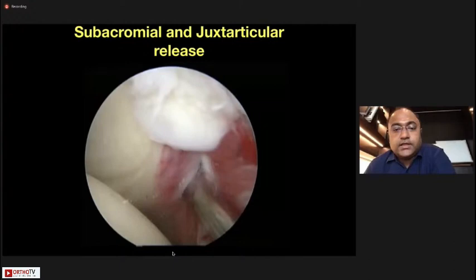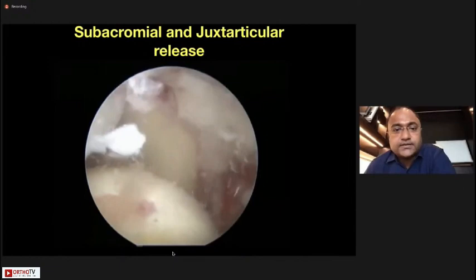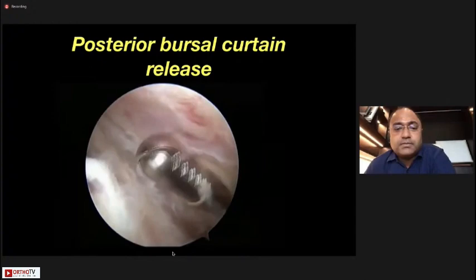Then release the posterior adhesions between the posterior cuff and the posterior glenoid. Now in the lateral portal, the liberator is in the posterior area — this is the juxta-articular release. We then release the posterior bursal curtain.